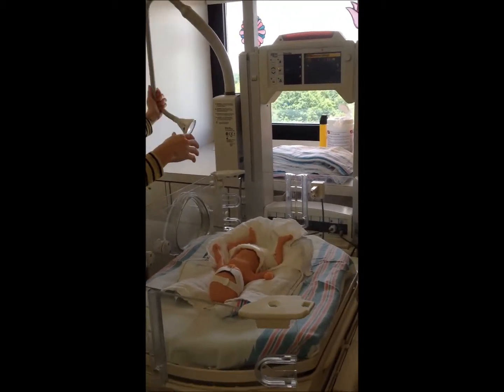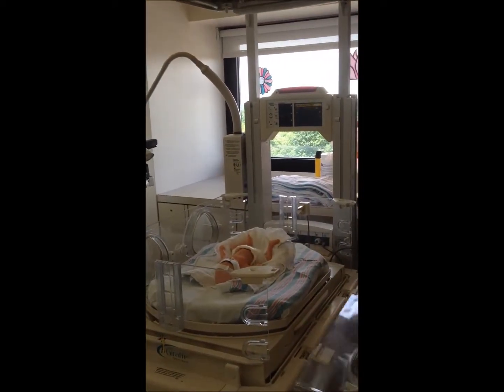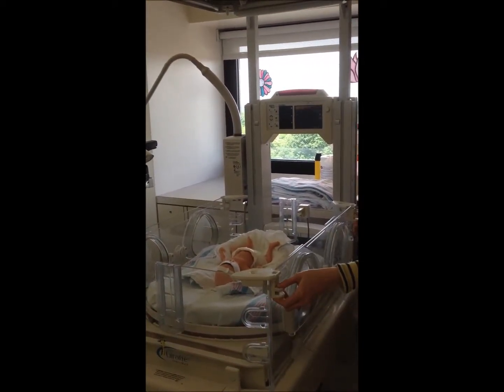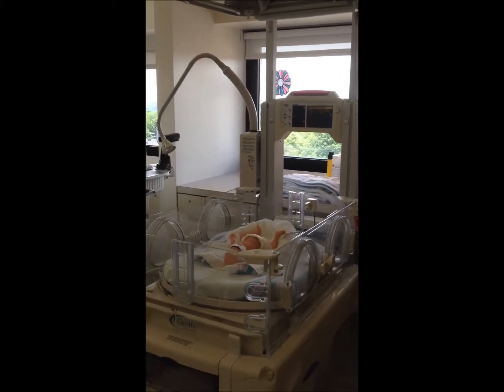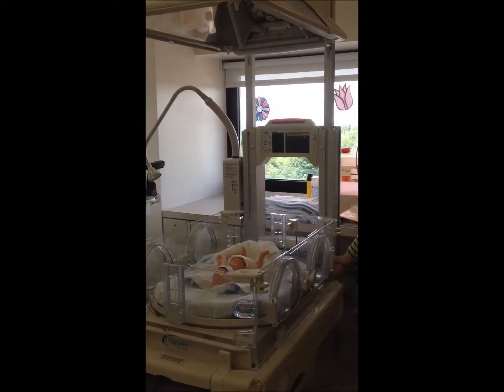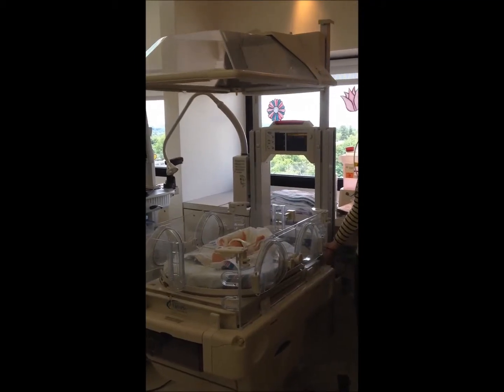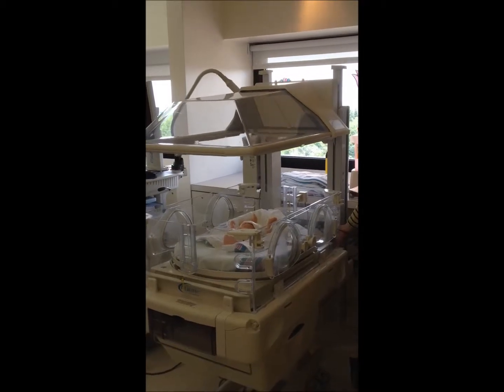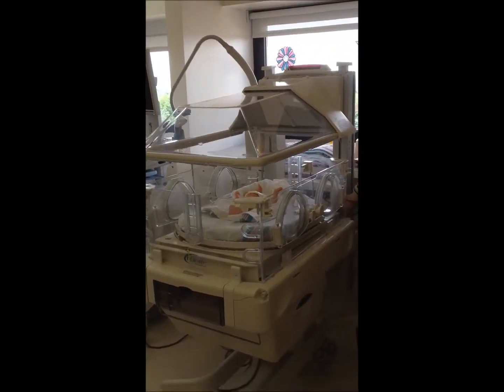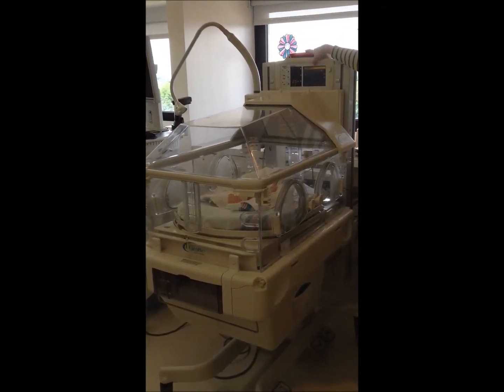That's terrific. So now that we consider the baby stable, can you just show us how the open bed would convert back to an isolette so that the baby would have an environment that's quieter and more conducive to resting? Absolutely. So to close our giraffe warmer, there's a button that we push on the side, and the top goes right down and secures into place to maintain their neutral thermal environment. Eliminates sound and external stimulus that are not ideal for teeny guys to have.